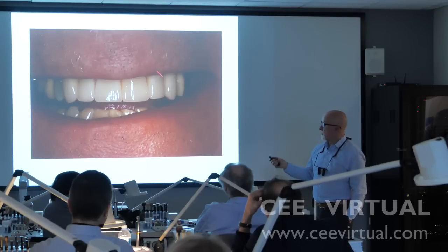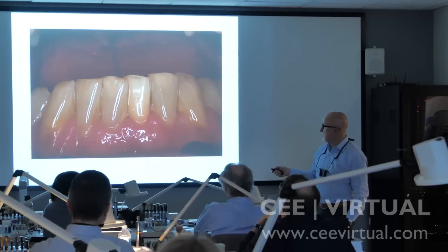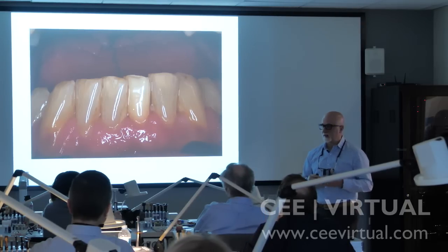Let me show you how you can use dentopreg where the patient is going to lose this tooth because of an abscess. He had previously placed endo, so what I want to do is extract this tooth.